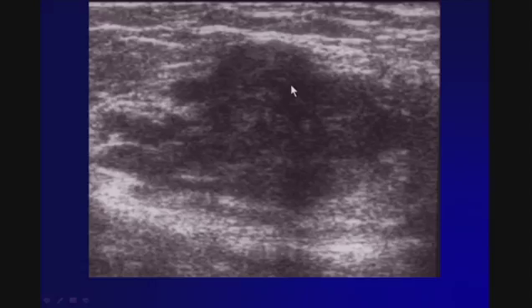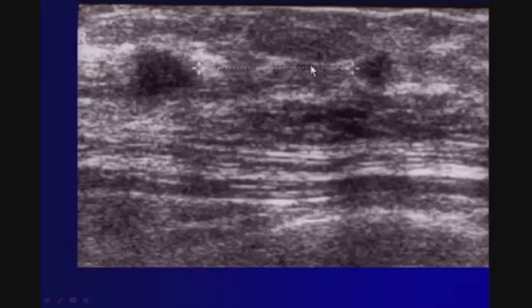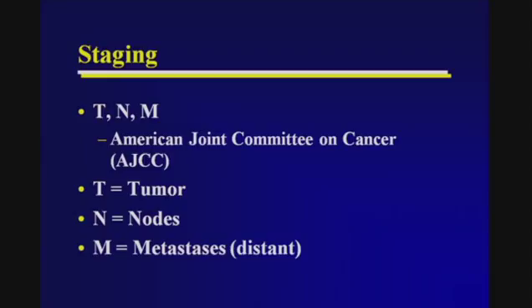What we would do in this case would be to biopsy the large lesion. For example, we do a core biopsy here. And then you could biopsy the lesion that's furthest away, such as this one. If we had good cytology support, we could do a fine needle aspiration. If not, we would do a core biopsy of this lesion and then place clips in both this lesion as well as the main mass. Now, regarding biopsy of the second lesion or the satellite lesion, FNA is a good option if you have good cytology support. If you don't have good cytology support, then you should proceed with core biopsy.